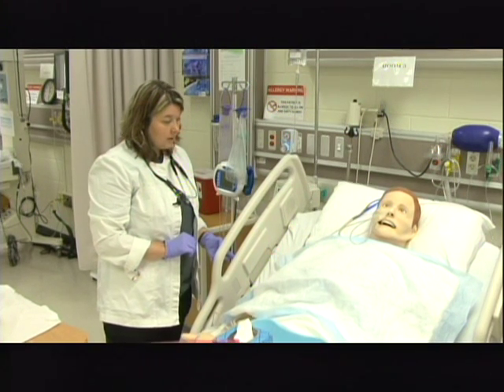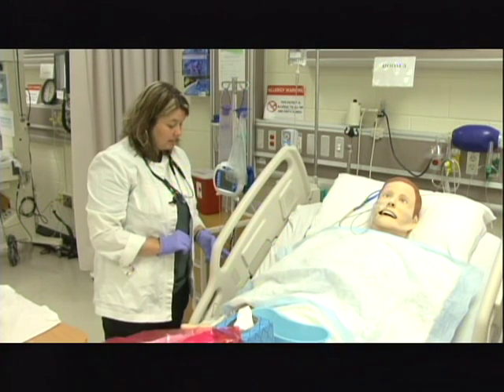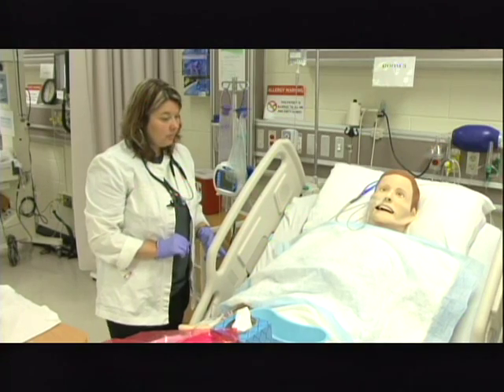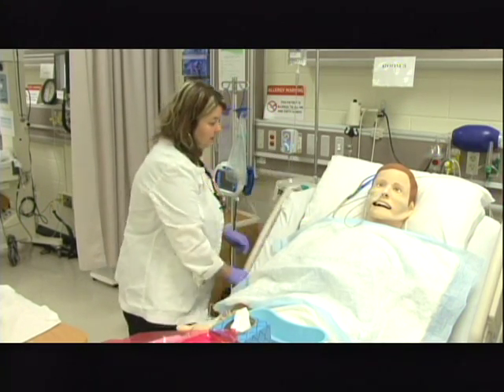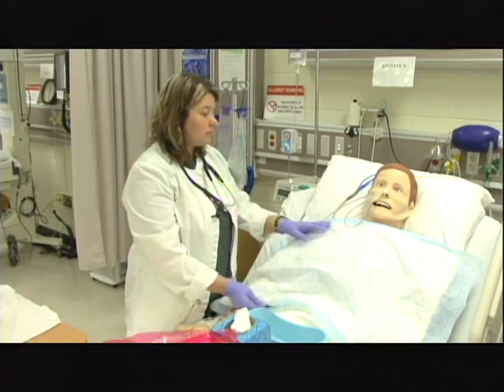And he can tolerate a higher position, so I probably am going to bring him up just a little bit. I can put the patient's bed rail down at this point if necessary, and I would probably prefer that, and I think he would too, so I can get there and move around a little bit better.